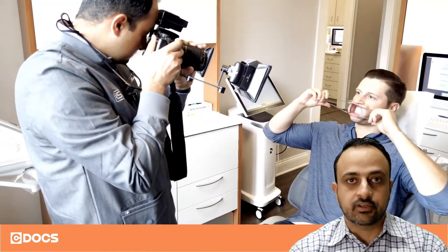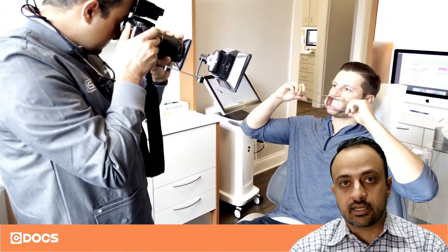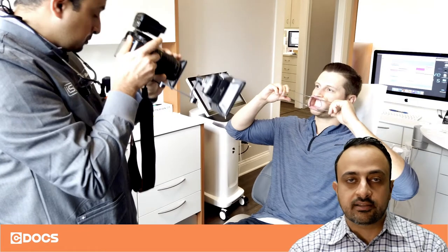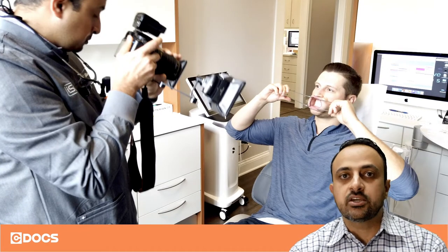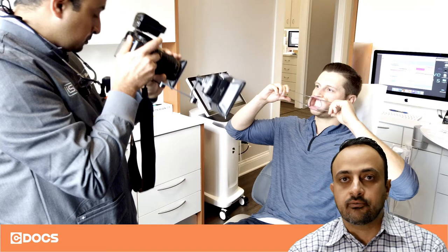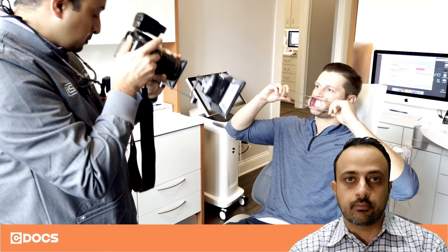We all know that photography is an important part of the co-diagnostic process. In my practice we take photos on every single new patient and it helps us to communicate our findings more effectively with our patients.